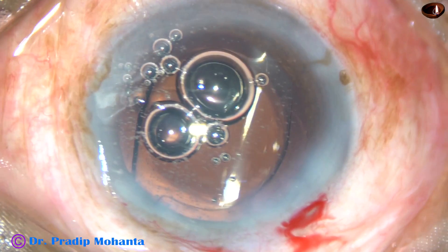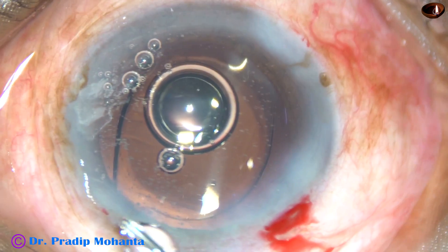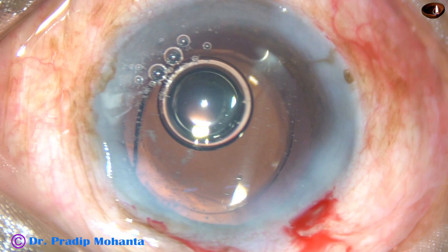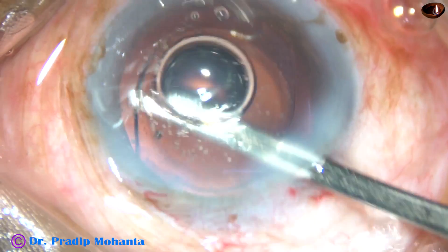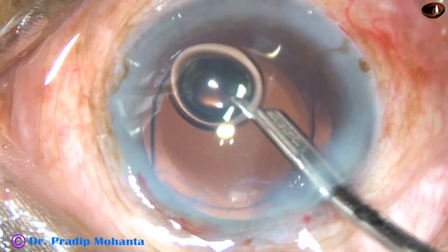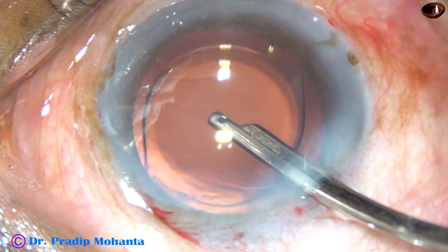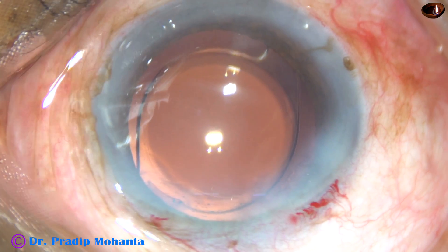This is a bit of moxifloxacin. While injecting moxifloxacin, a lot of air bubbles went in. The side ports are hydrated. And now this is the final lavage of the anterior chamber. BSS is first irrigated, and after a few seconds, aspiration is carried out. The anterior chamber is formed and the case is concluded.